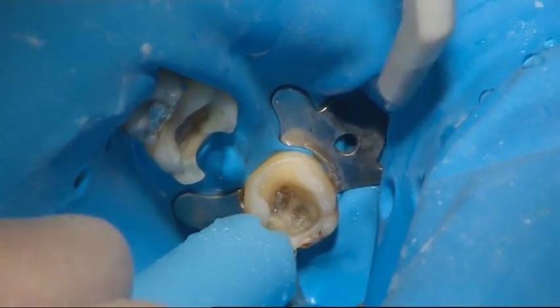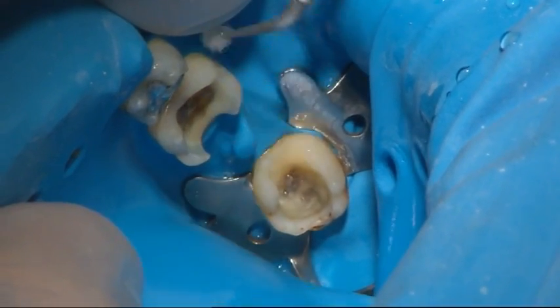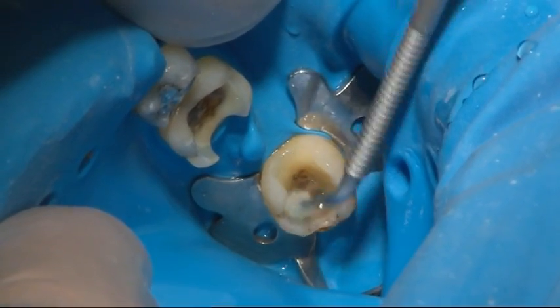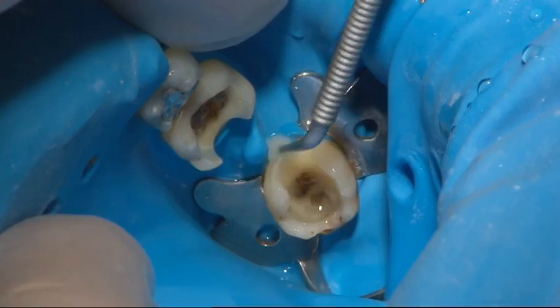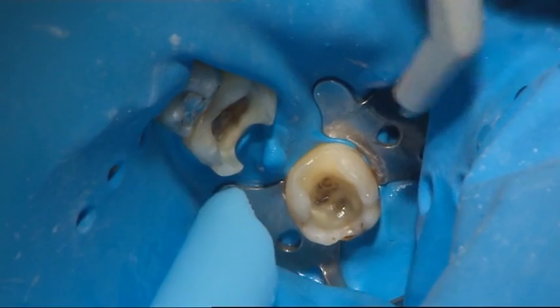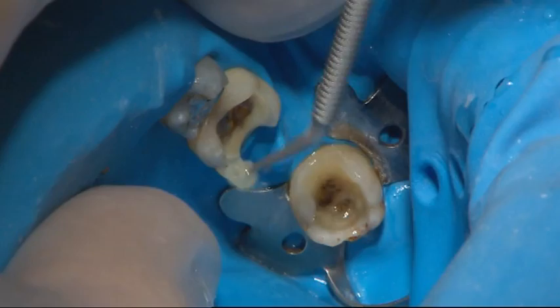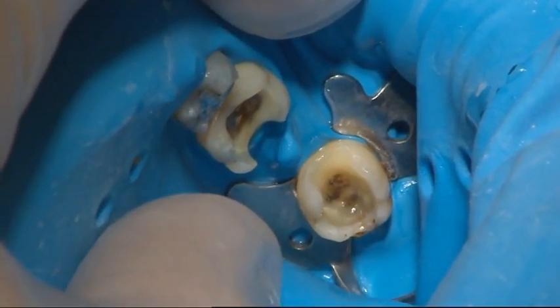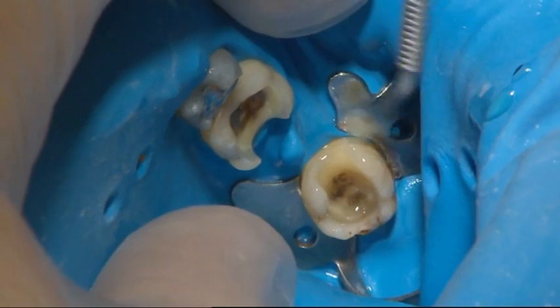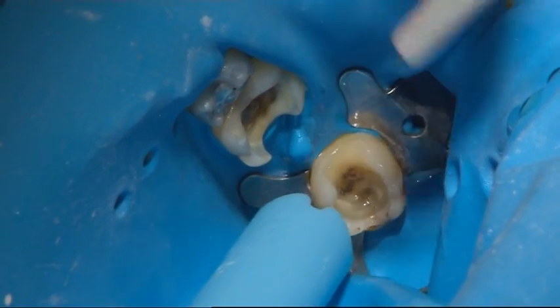The working area was kept dry during bonding and layering of composite — use of a rubber dam is highly recommended. The teeth surfaces were bonded using separate primer and adhesive according to the bonding agent manufacturer's instructions, and the bonding agent was light cured as described by the manufacturer.